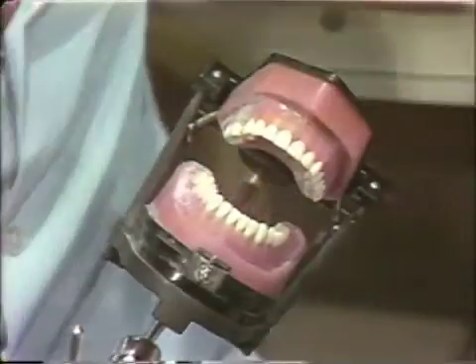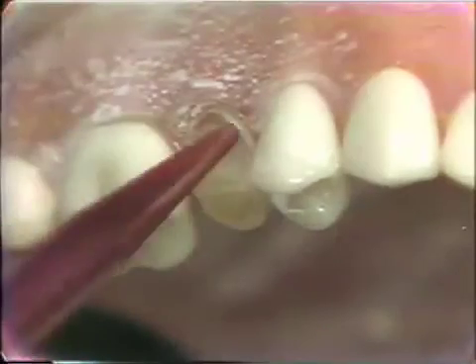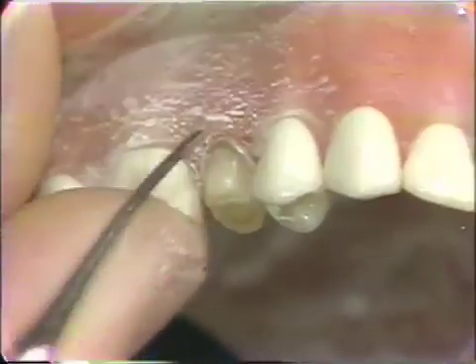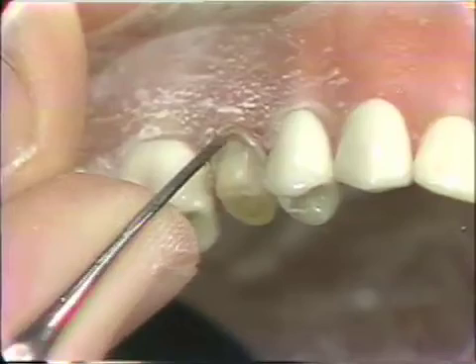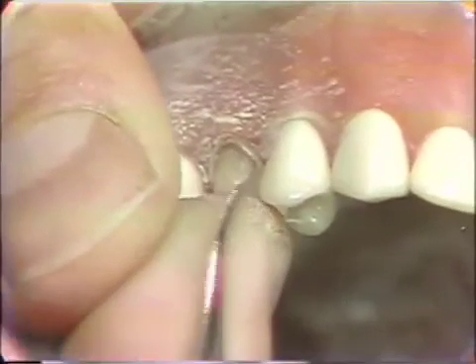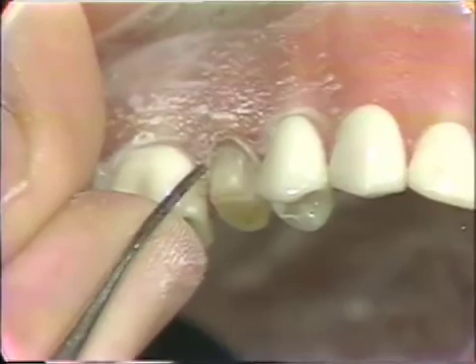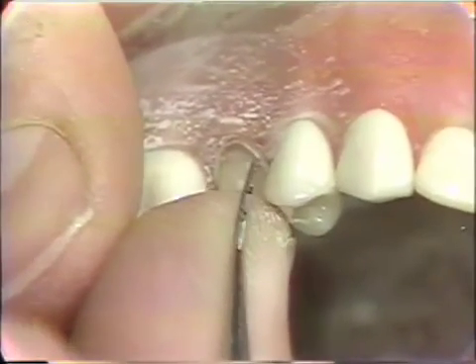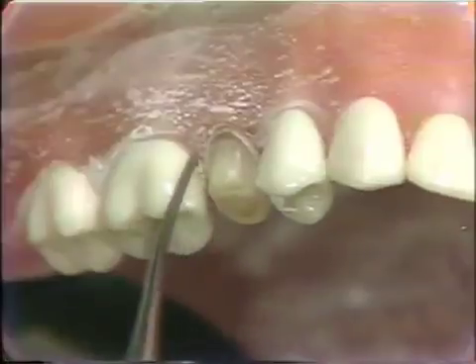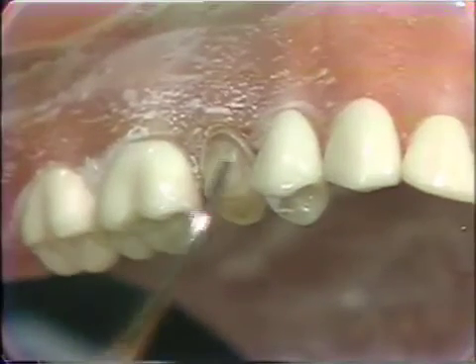Now we'll just dust this off. We have a little bit of roughness on the shoulder and the bevel is already established. You can use a Wedelstat to make sure that any unsupported enamel rods are not left in the preparation. Our finishing line goes beyond this, but it's still a good idea to dress this up so there are no enamel rods breaking off after you seat the crown. With a millimeter and a half reduction, our gold collar placed all the way around the labial, the chamfer on the lingual, and enough occlusal reduction, we have completed our preparation on this bicuspid.